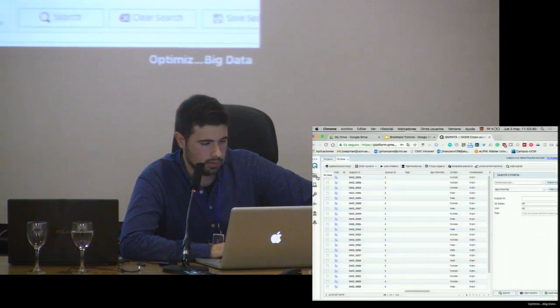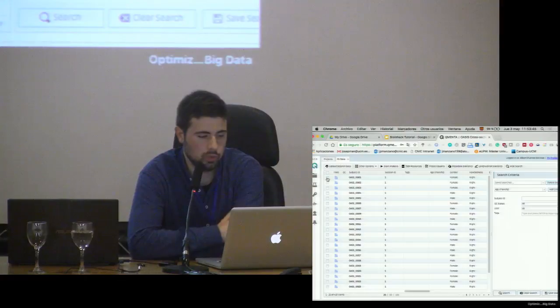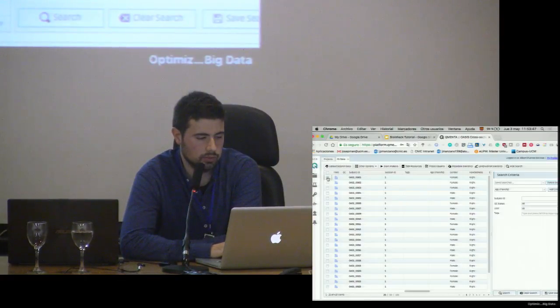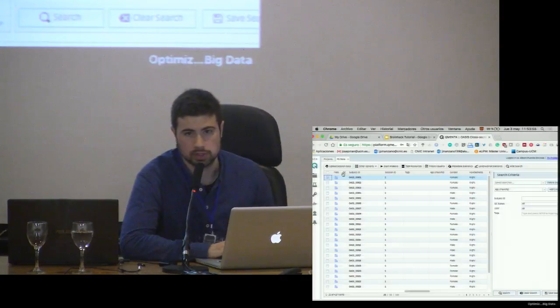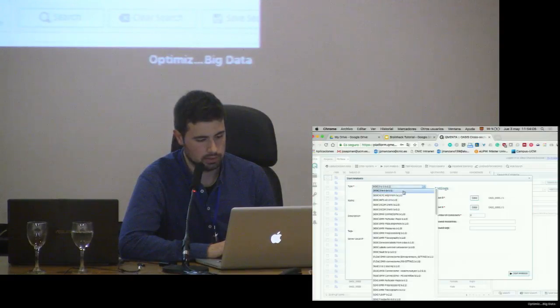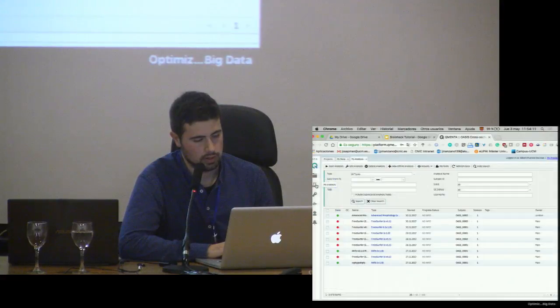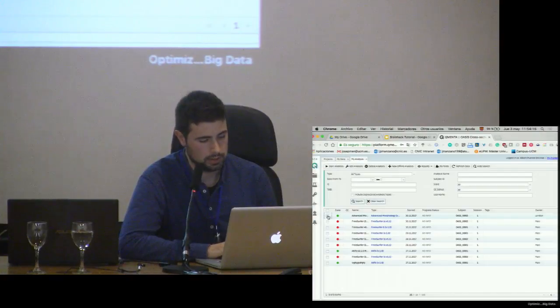And then you have the analyses themselves. So this connects with the challenge. What we are going to do is try to make a tool that receives a subject's data, receives a subject's T1, and computes their age. It guesses the age of that patient. Your analysis is going to be launched as any other analysis, which is by selecting one of the subjects and then selecting one of the tools that we have. And then it's going to output the age in a text file. I'm going to explain this later in a bit more detail.